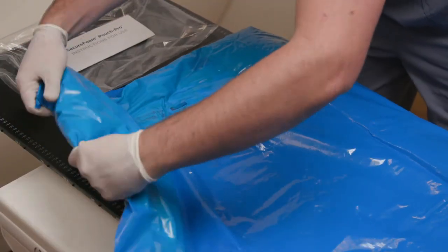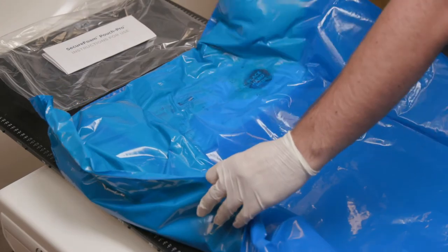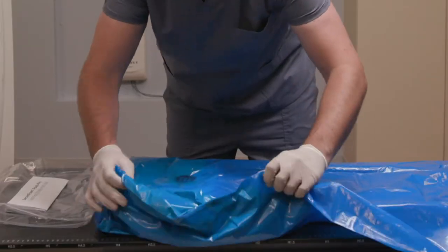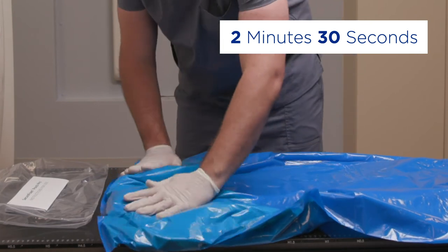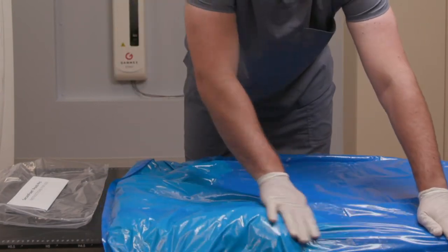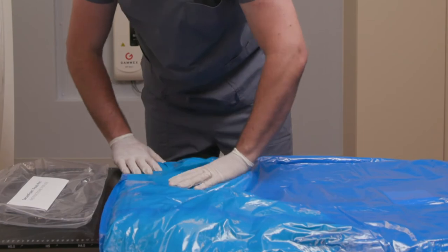You can now manipulate and contour the SecureFoam around your patient until the mold begins to form. The SecureFoam will remain pliable for about 2 minutes and 30 seconds after it bursts from the pouch. Use this time to contour the mold around the shape of your patient's body.